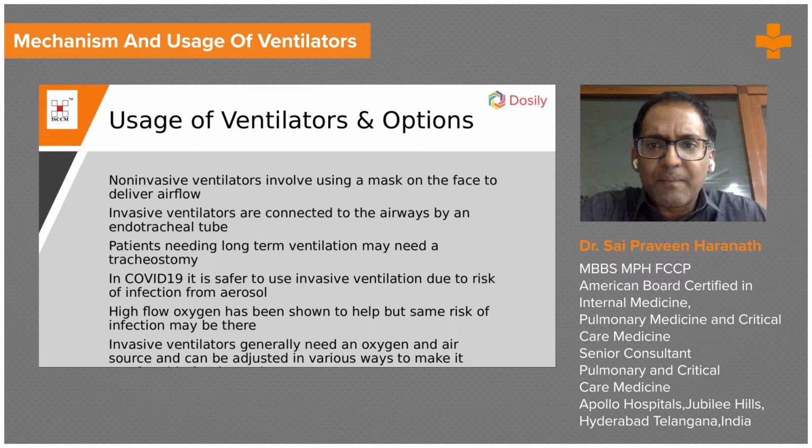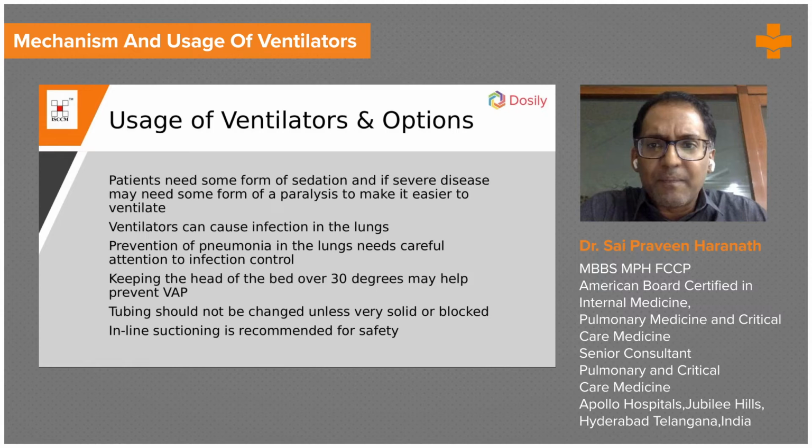We also need to consider a situation where you may need long-term ventilation after they've recovered, where you need a tracheostomy, which is essentially oxygen being connected through the neck. You also need to consider a situation where you don't use a ventilator, but use something called high flow oxygen, which has a lot of benefits. And you have to also adjust the oxygen in a ventilator so that you give enough, but not too much. So these are all concepts you learn about.